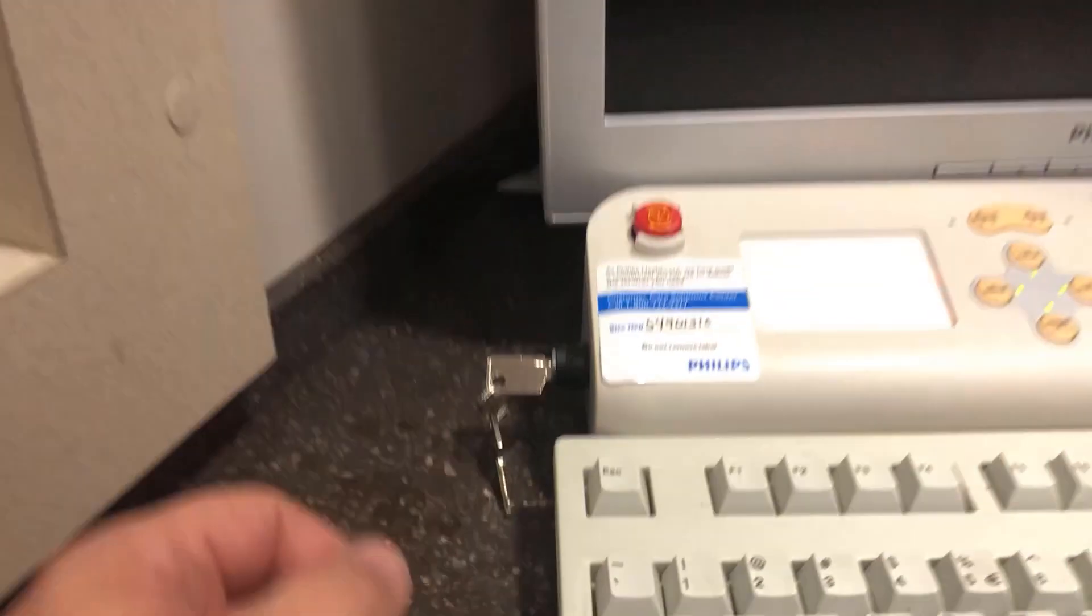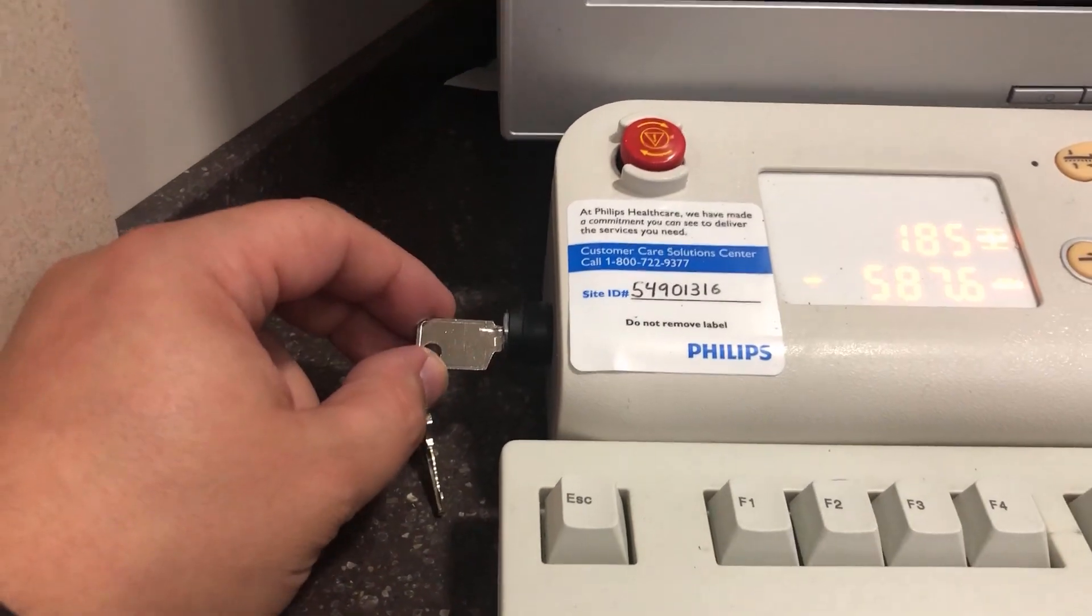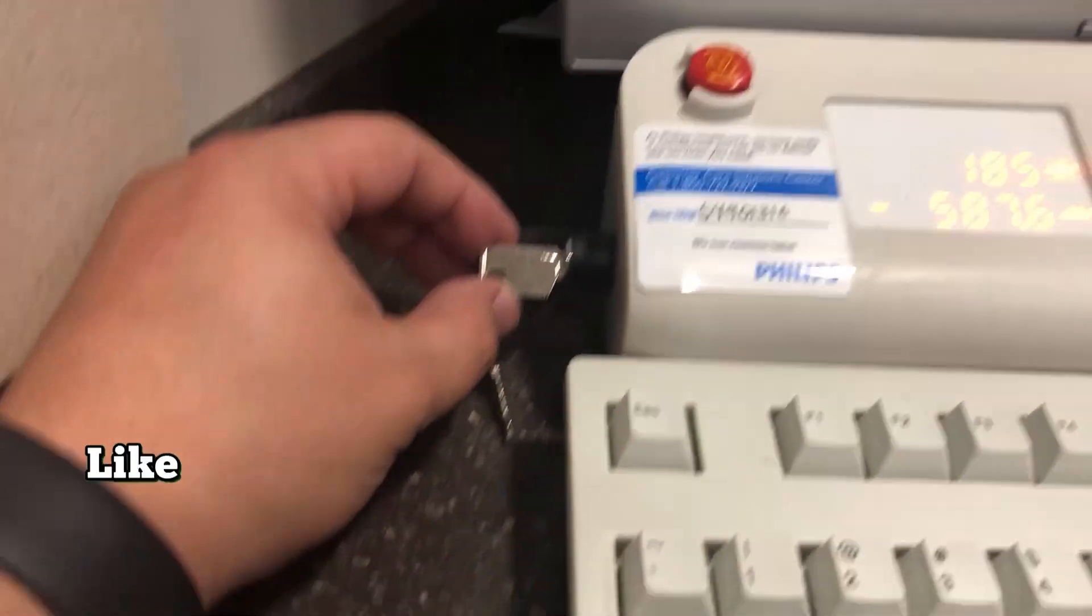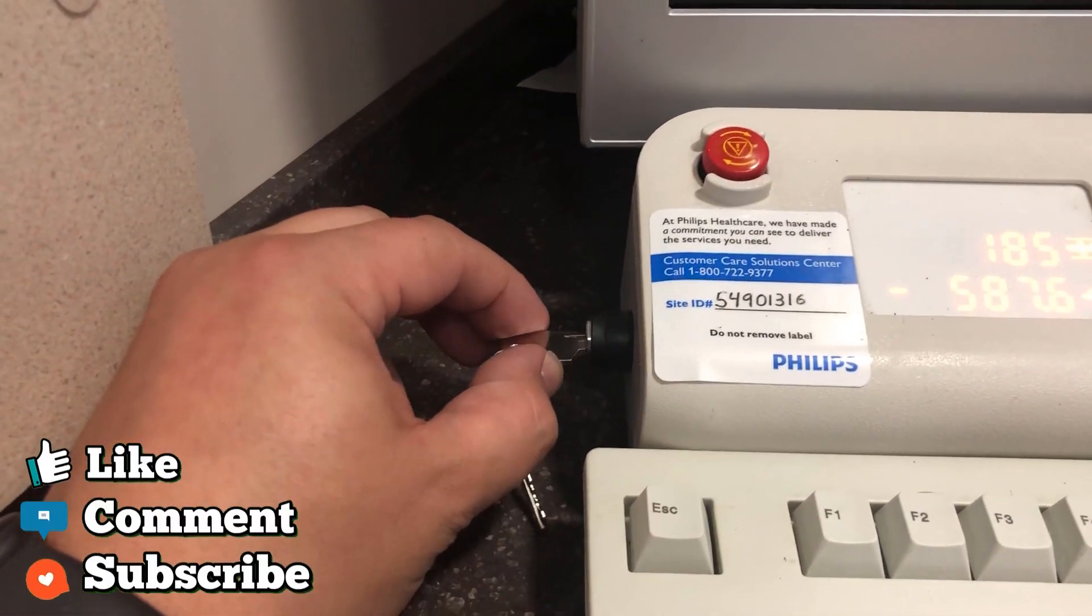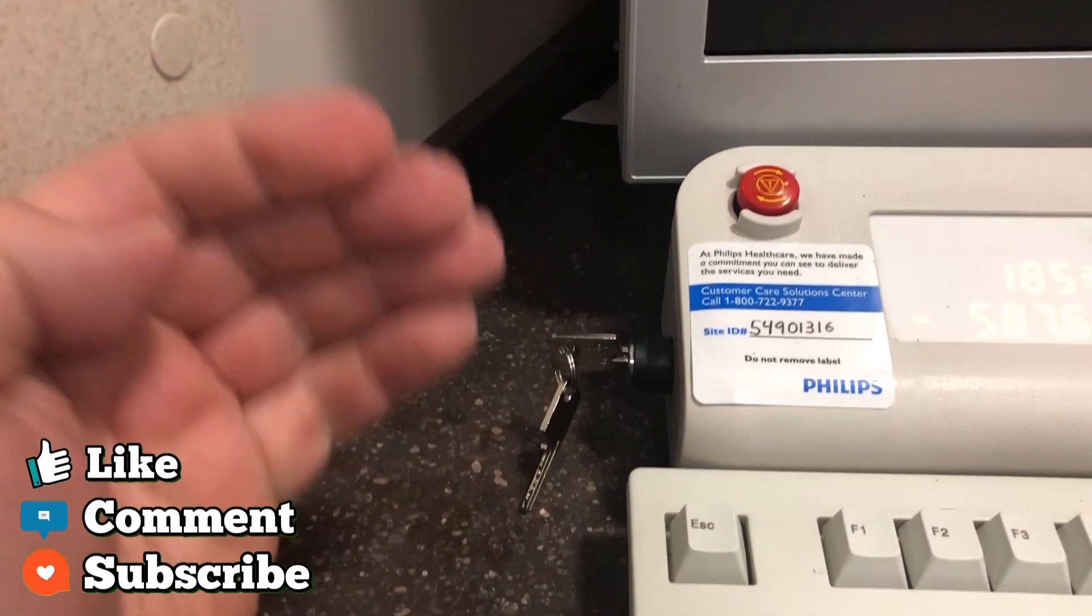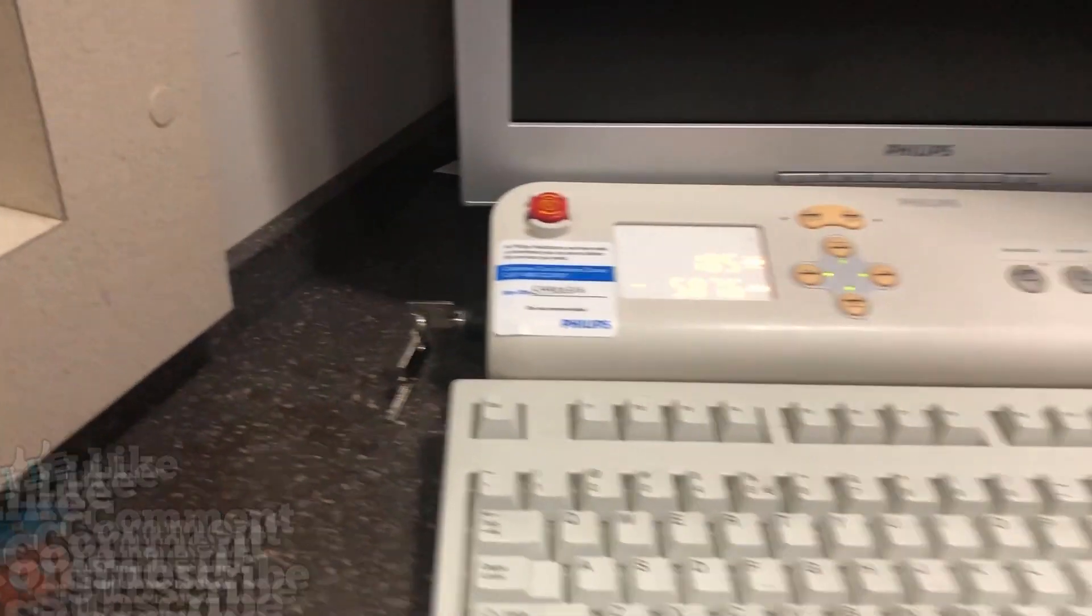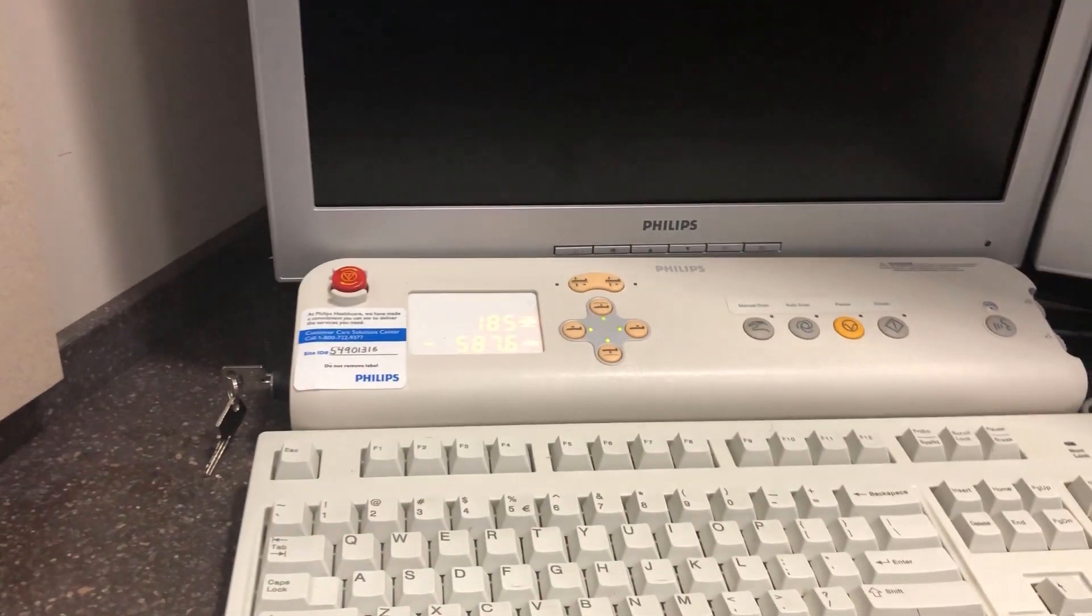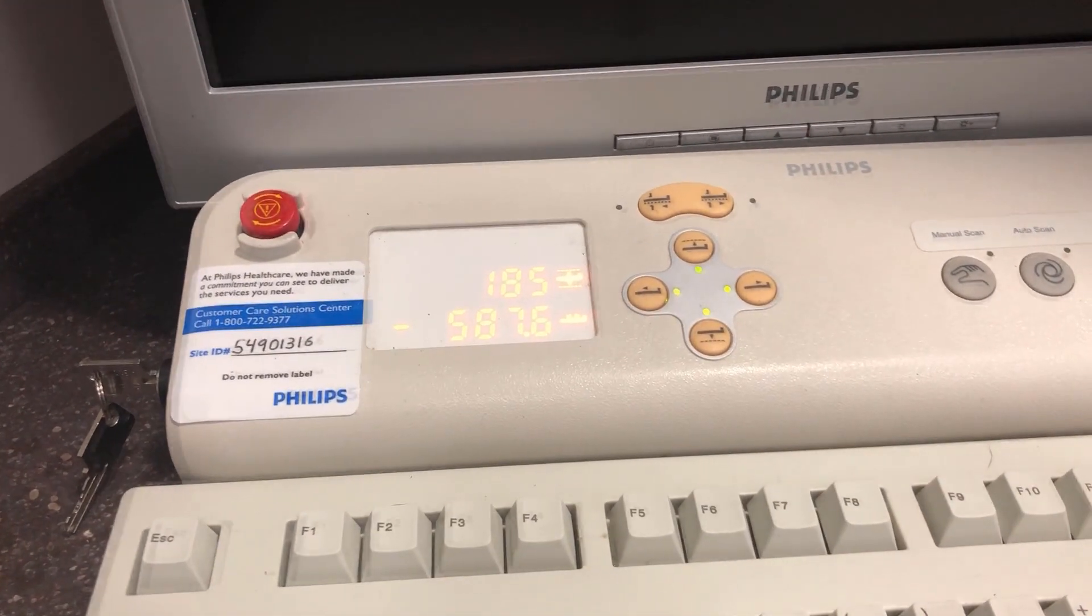We're going to come over here, this is the gantry switch, we're going to turn it to the off position, straight up and down. I'm going to let the gantry power off.